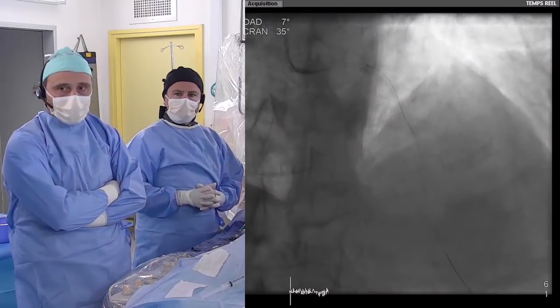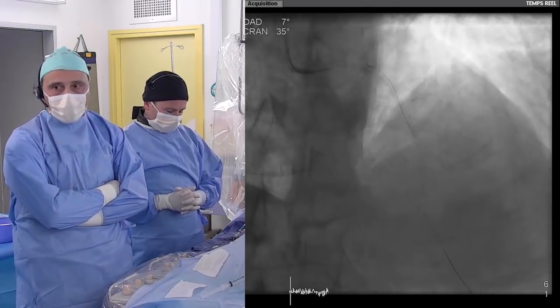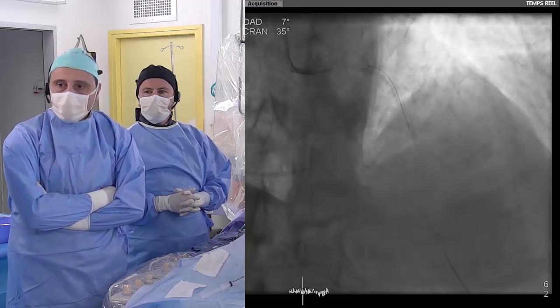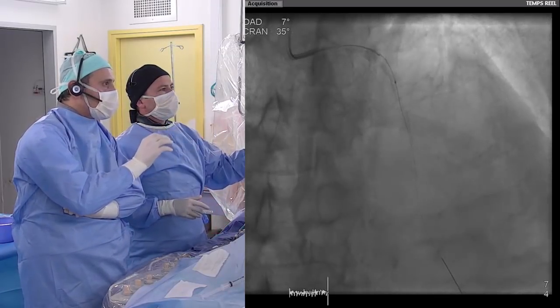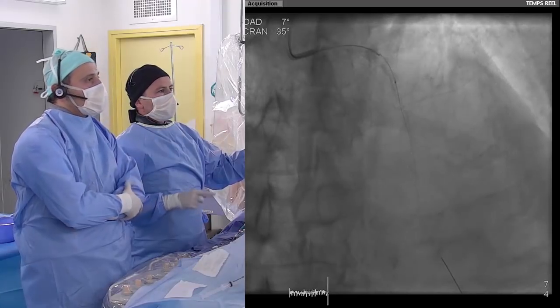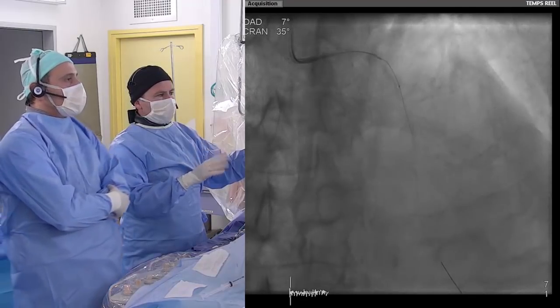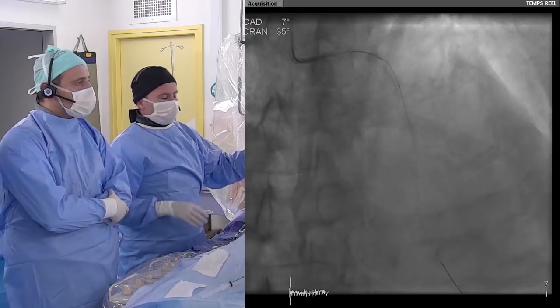I mean, these are major decisions that we better take in an informed fashion. And that is why I think we rightly performed IVUS. We might first see on the fluoroscopy the way the IVUS catheter progressed during the lesion. We start with the left main just to assess the lesion, which is quite, this is intermediate.